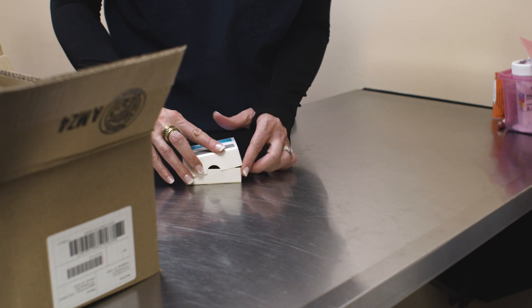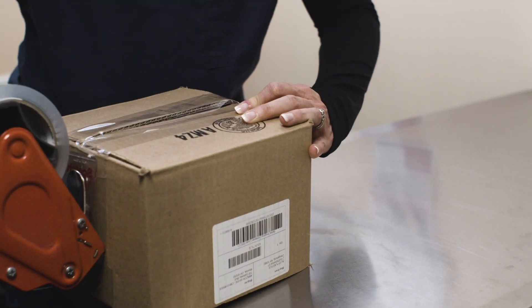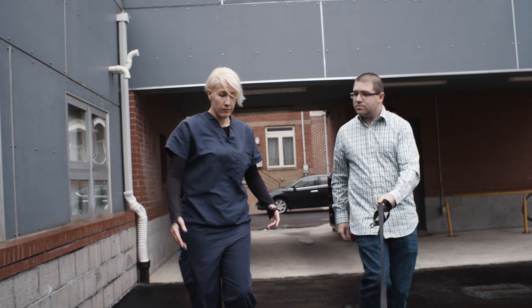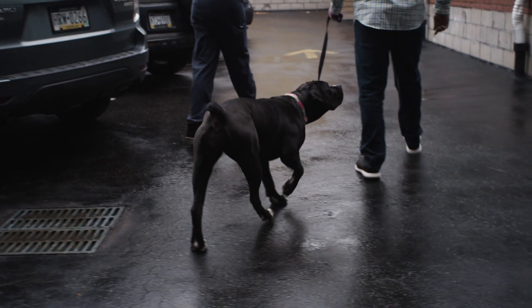Then veterinarians go off to practice and the realities of the industry slow things down. Without the clinical pathologist down the hall, samples are packaged up and shipped to the lab. Turnaround time takes days, and as a result, the value of cytology goes down.